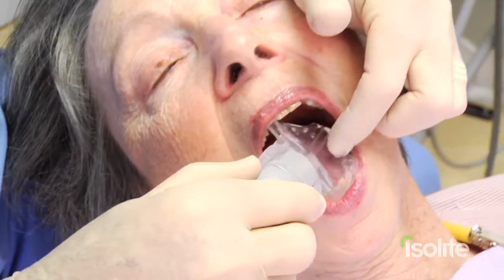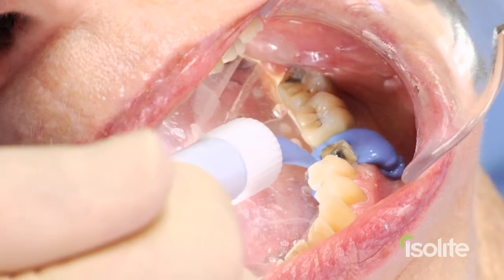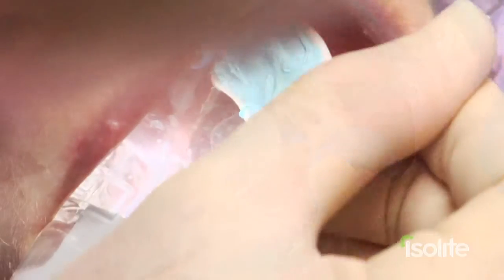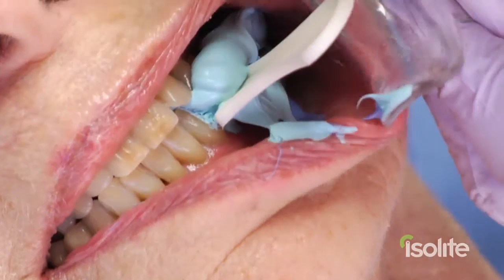We'll put this back in the mouth, inject the PVS impression material around the tooth, insert the triple tray, open wide, remove the Isolite, and bite down. And that's how we take our triple tray impression.